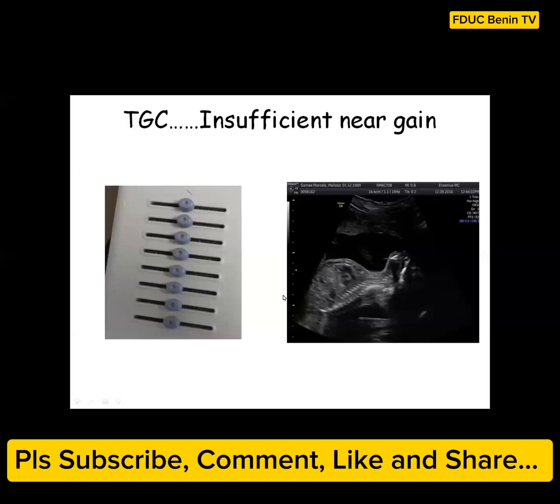All right. So this is the time gain compensation I was talking about. Each of these sliders represents a different depth of the area of study.